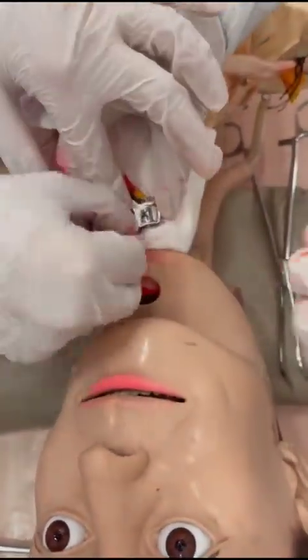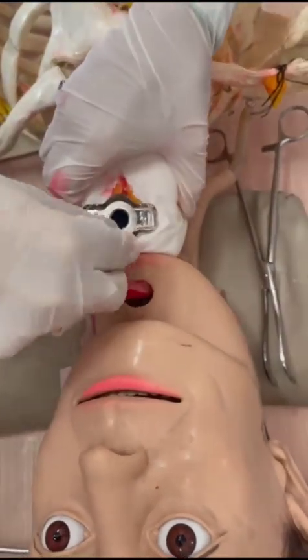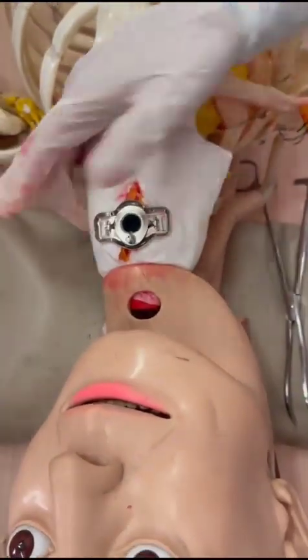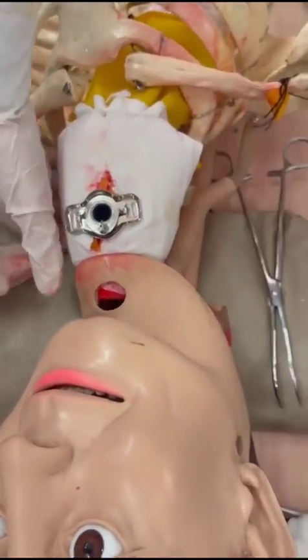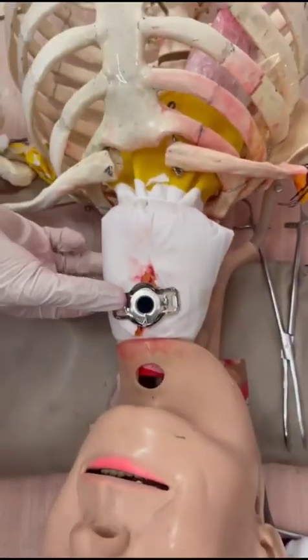Although there are many variations in performing a classical open surgical tracheostomy, these are all based on a standard technique composed of a few fundamental steps, a safe procedure in experienced hands or where there is adequate supervision.